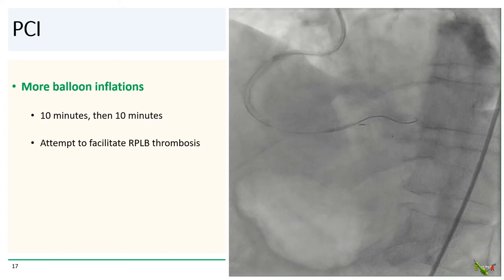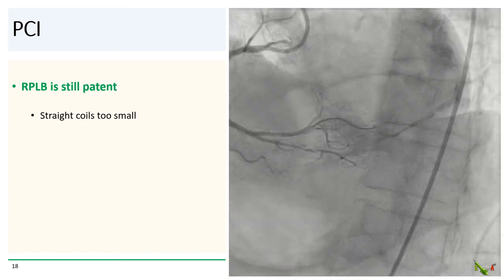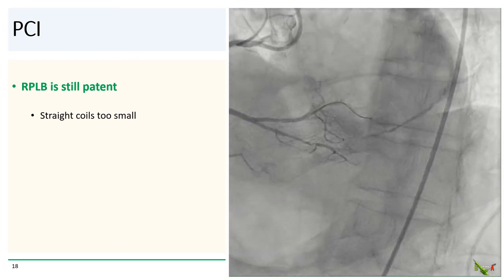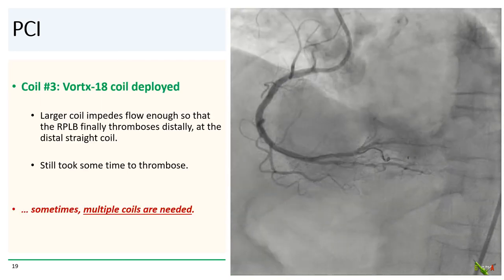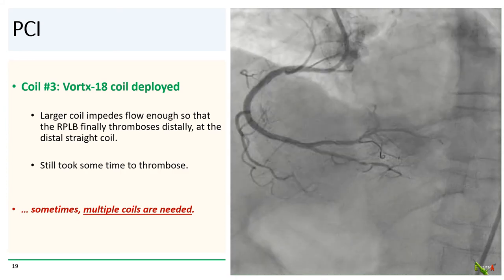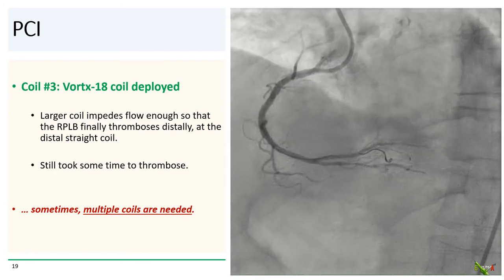We performed more balloon inflations — 10 minutes, then another 10 minutes — to attempt to facilitate thrombosis of the vessel. But despite repeated prolonged balloon inflations, the RPLB was still patent and the straight coils were probably too small. So we deployed coil number three, the spring-like Vortex 18 coil, which is meant for slightly larger vessels. Finally, with this third larger coil, flow was impeded enough that the RPLB thrombosed distally near the straight coils.